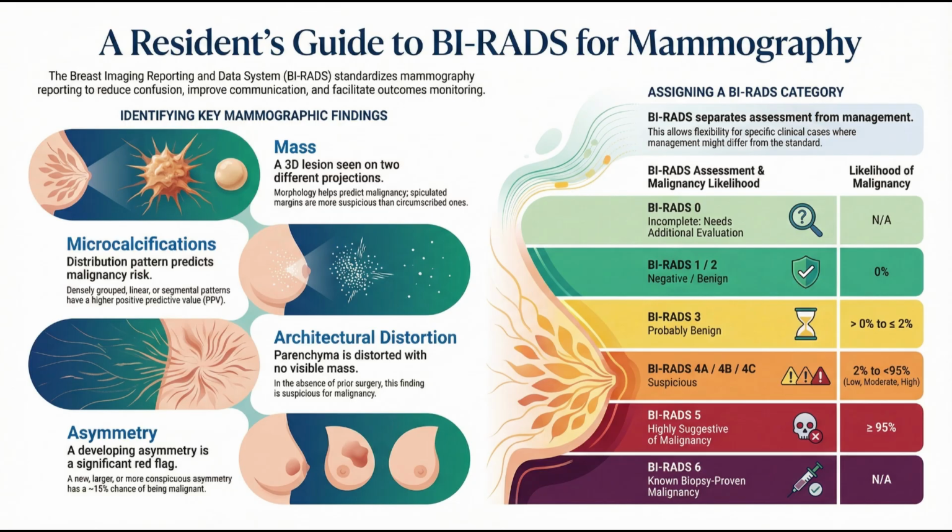A great example is popcorn-like calcifications. They're big, classic, benign calcifications, usually larger than 2 to 3 millimeters. We often see them with an involuting fibroadenoma. Okay, break that down for us. What's an involuting fibroadenoma? It just means a benign tumor, a fibroadenoma that's basically dying off and hardening. It's calcifying as it shrinks, so it's a sign of a self-limiting benign process.